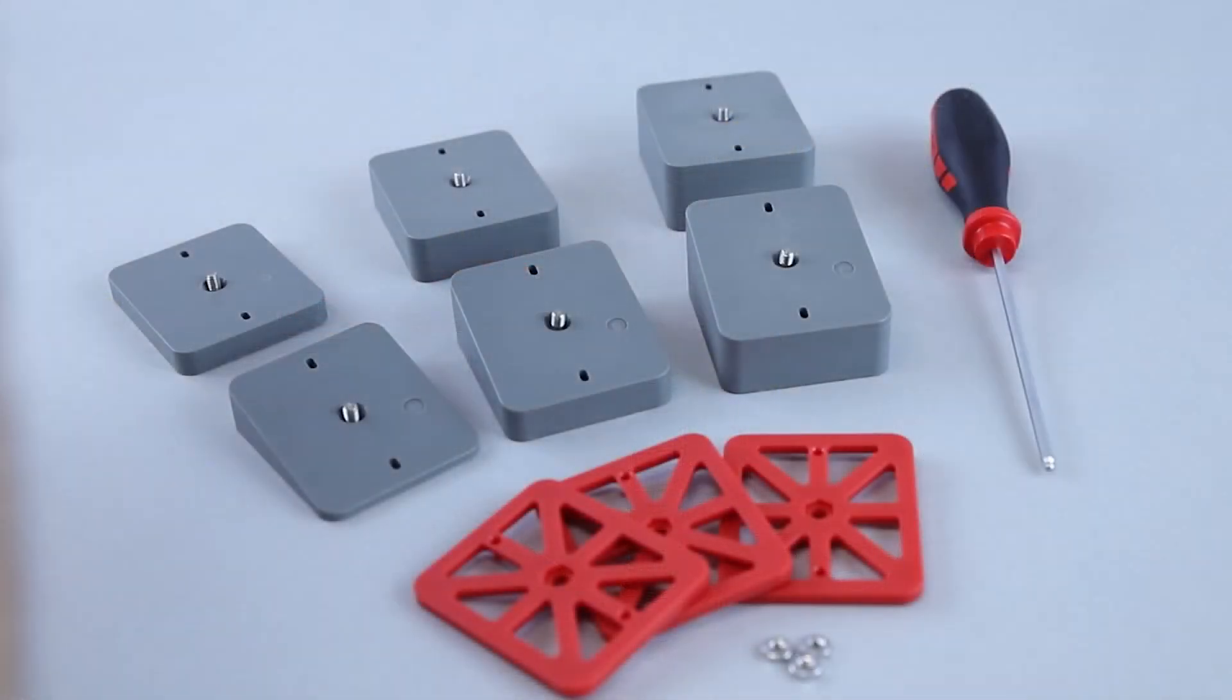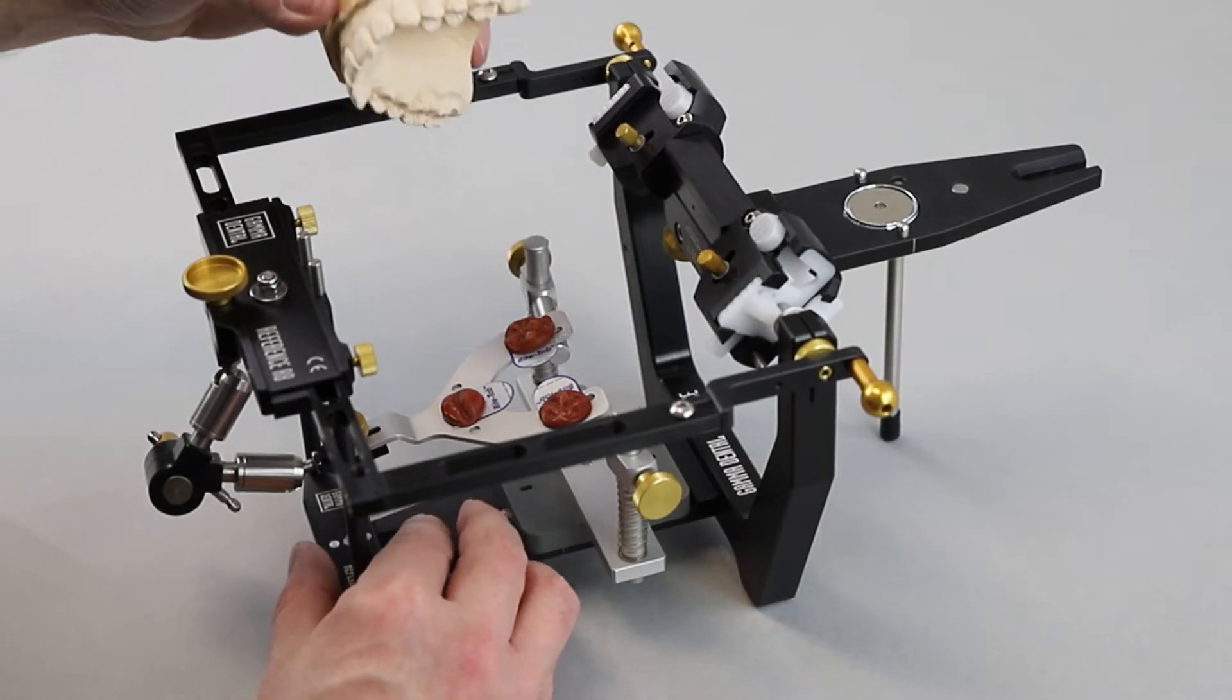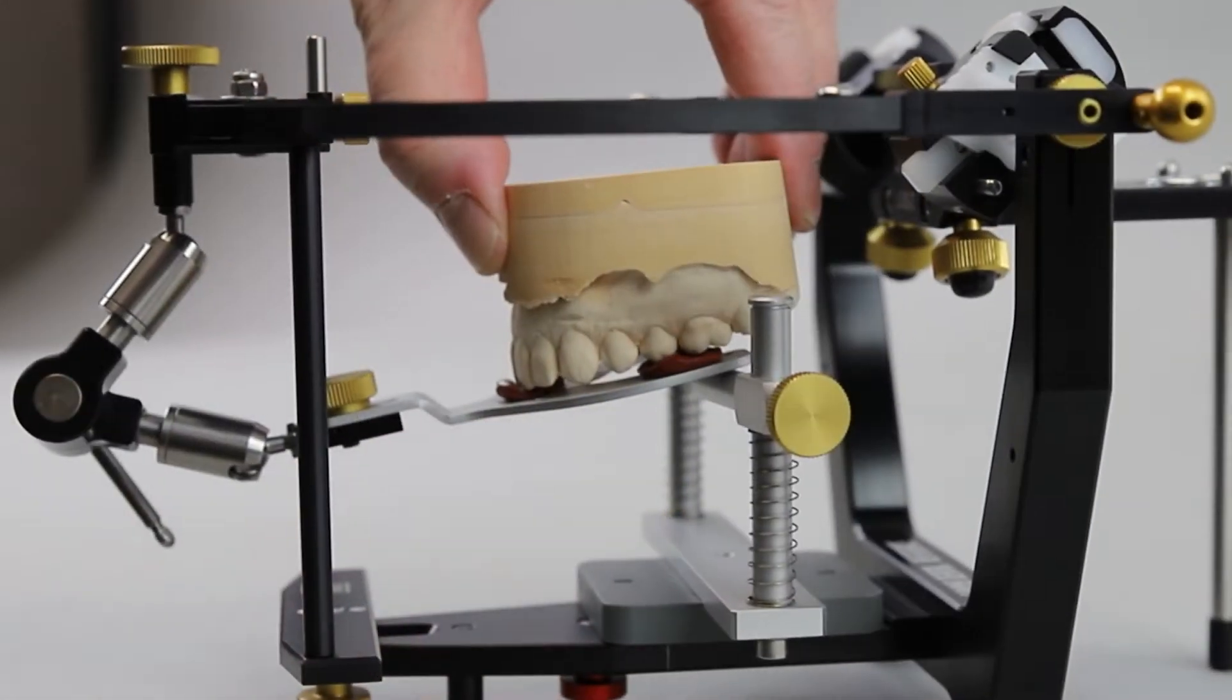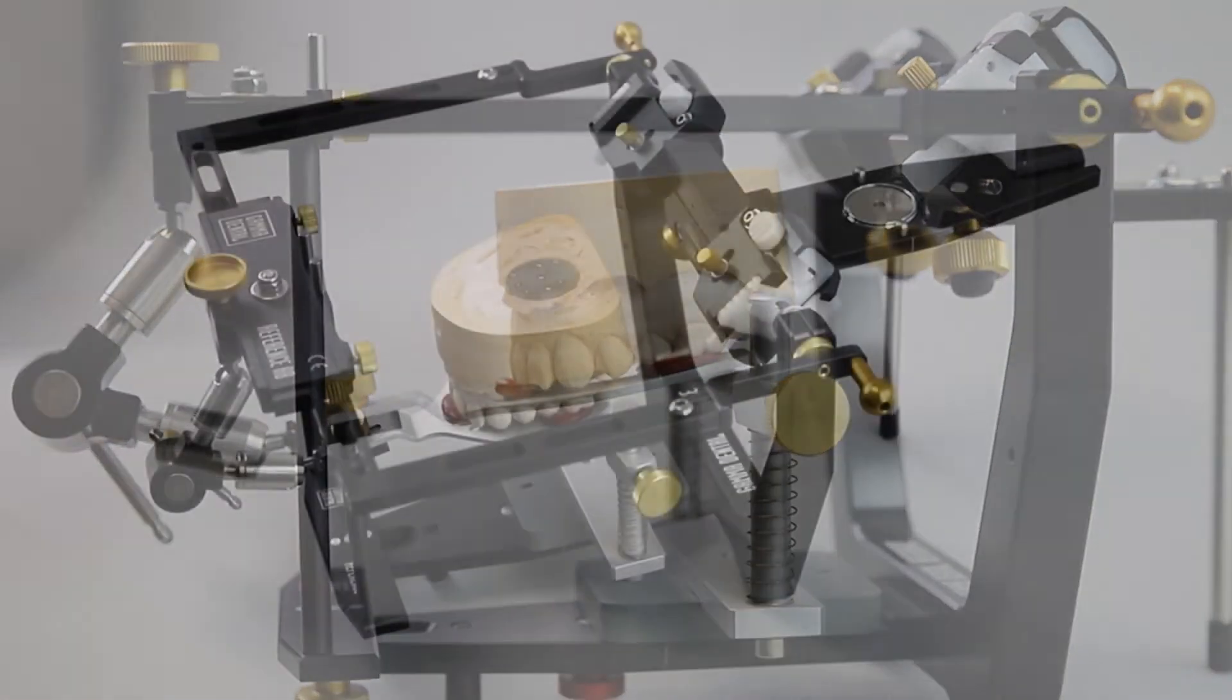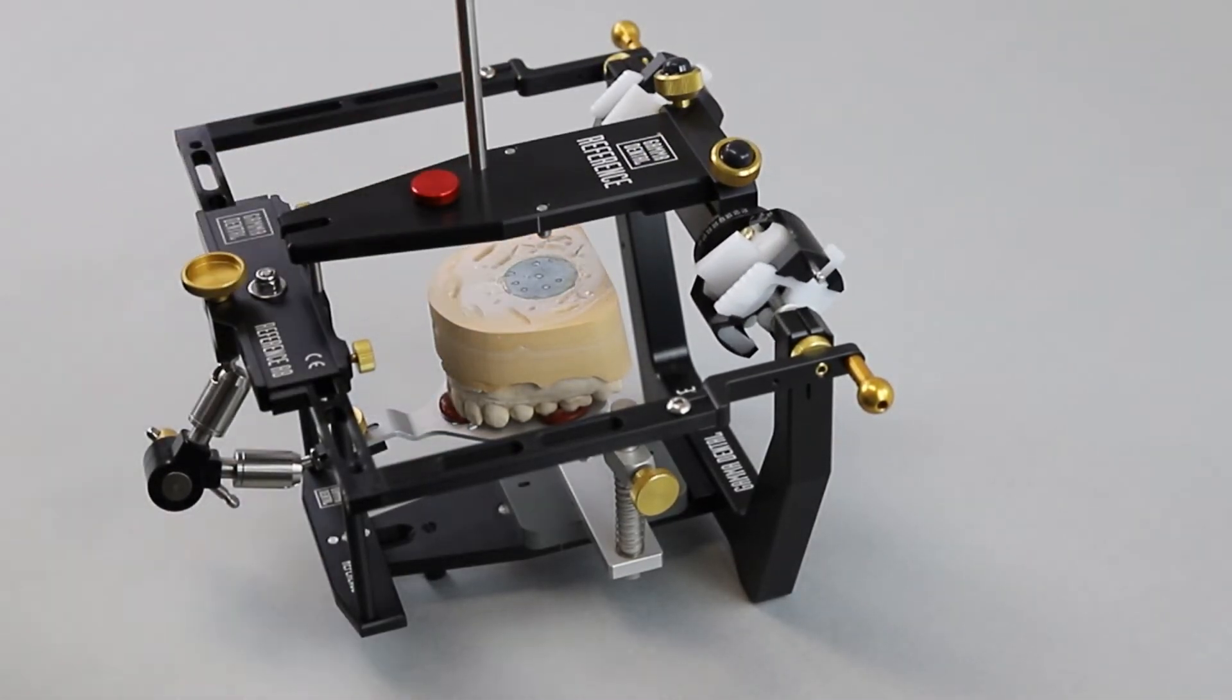The next step is to select the ideal distance block. First, the upper jaw model must be set into the corresponding impressions on the bite fork. Then close the upper section of the articulator so that it rests in solid contact on the anterior face bow pins.